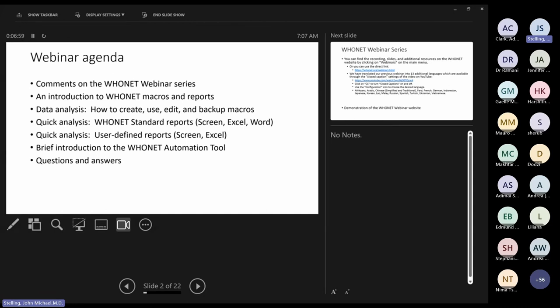We'll see how to combine macros together to do many different kinds of analyses. We'll see two kinds of reports: Hoonet standard reports that we have given to you — predefined fixed reports available on screen, Excel, and Word — and user-defined reports where you choose the analyses, parameters, and organisms. At present, user-defined reports are only available in screen and Excel, but in 2024 we will be making options for user-defined Word reports.